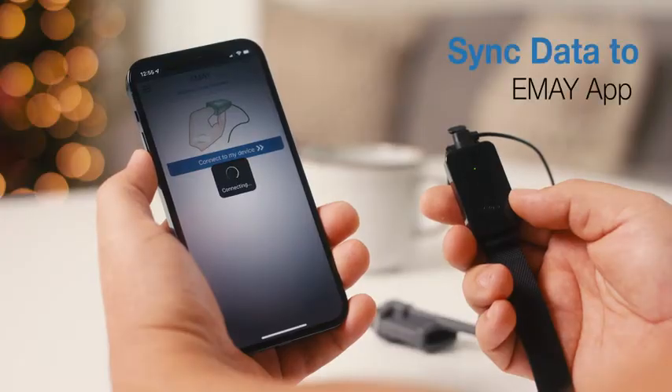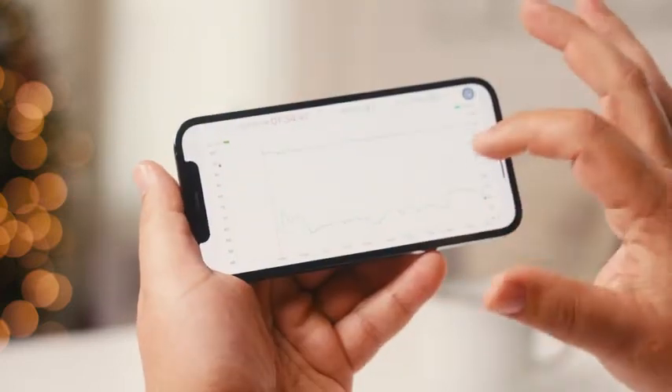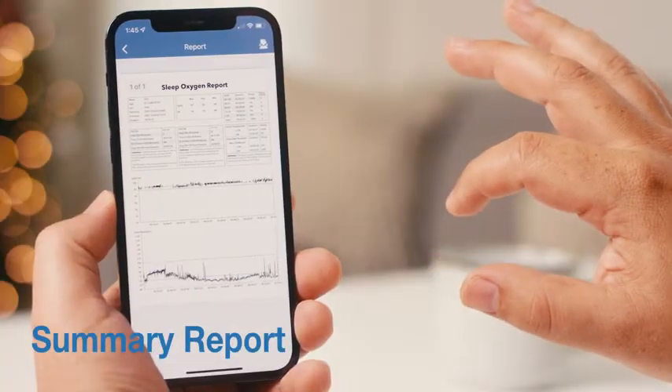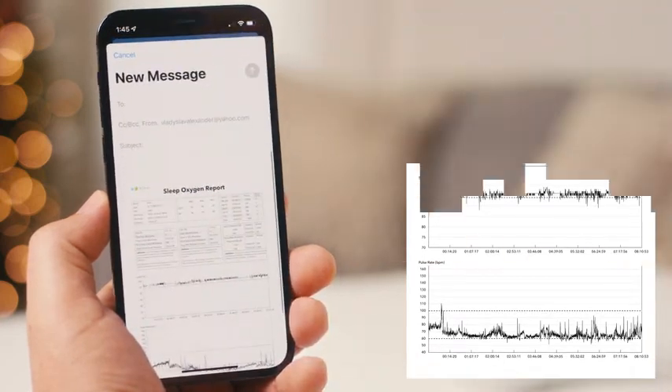Sync the recorded data to your smartphone using the EMEI app in the morning. EMEI makes it simple to review all of your data second by second, and allows you to get a sleep report with ODI 3, ODI 4, and graphic trends of blood oxygen.